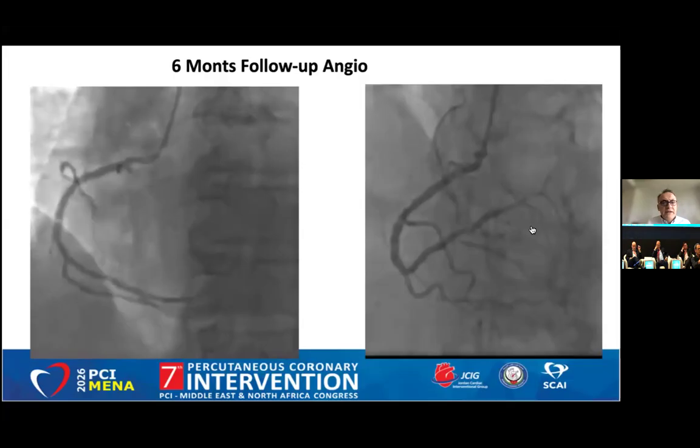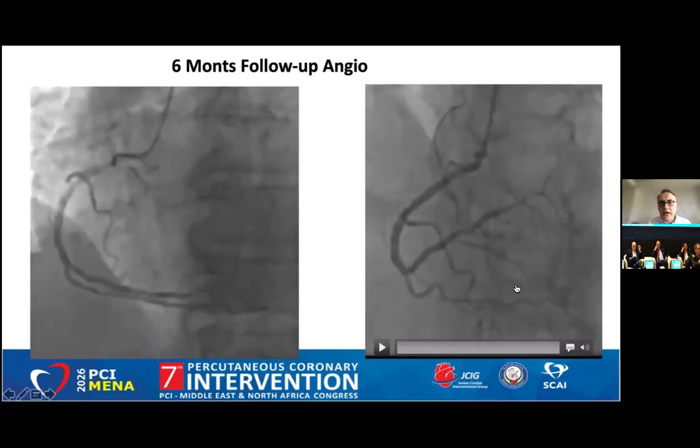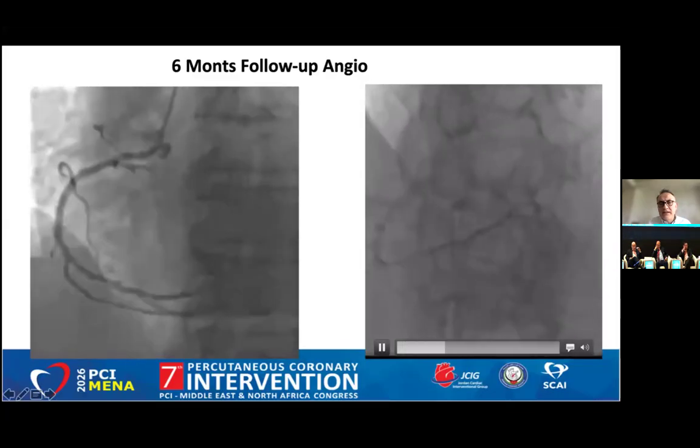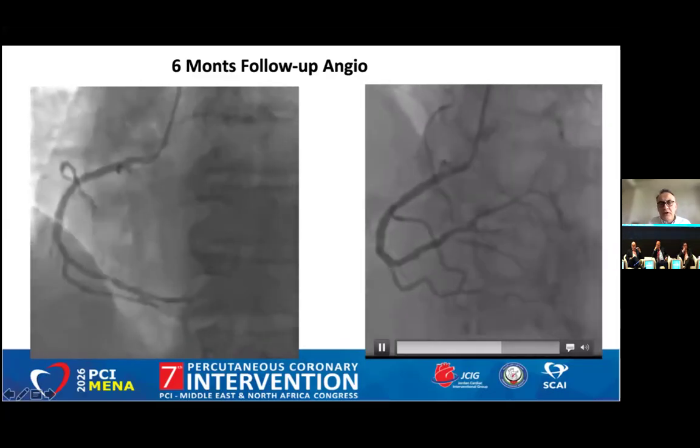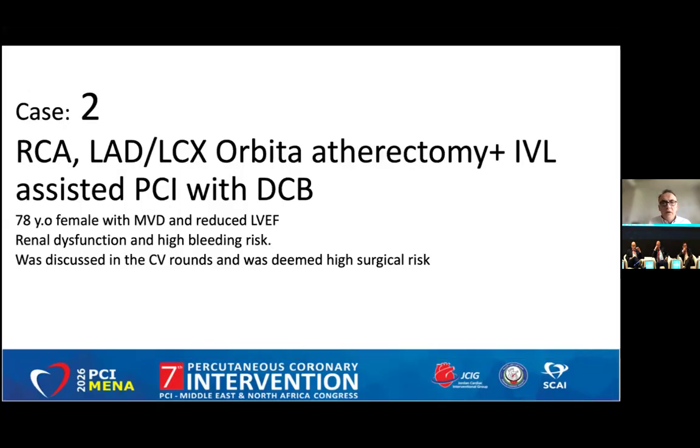And then we had a 6 months follow-up of this patient, and we still have nice flow. Of course, we have some plaques, but the flow is very good. We are very happy about the result. I want to show you another case.